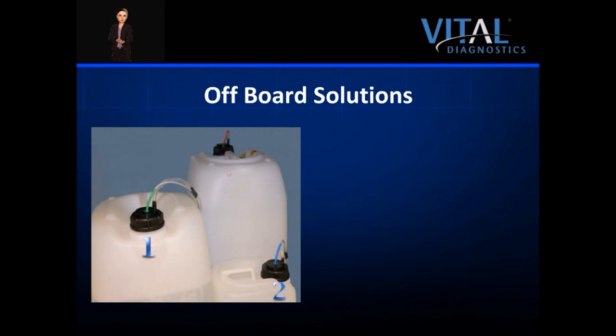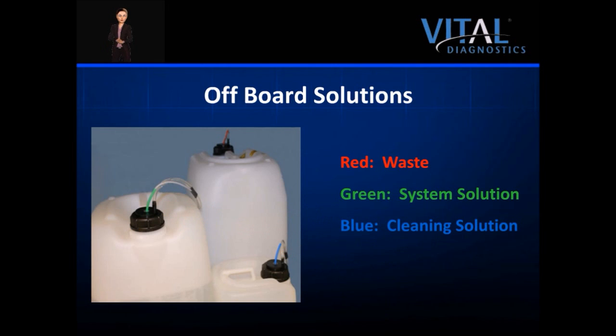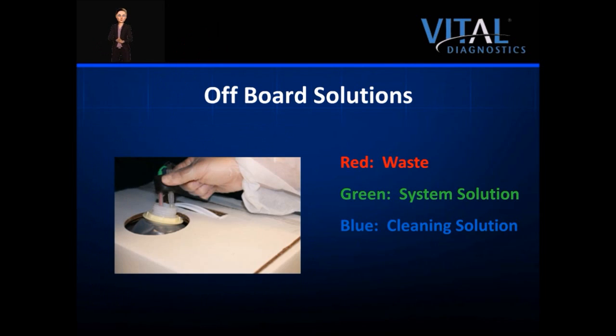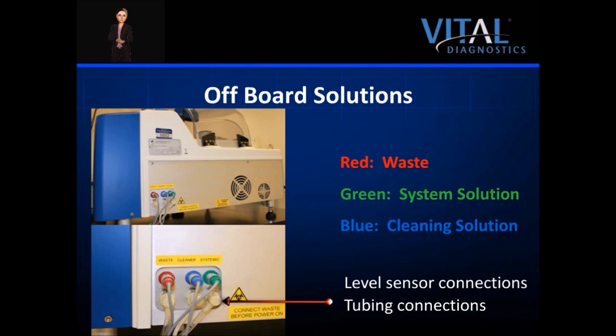There are two off-board solution containers and one waste container required for operation. The tanks can be stored under the analyzer. If the instrument is located in close proximity to the drain and local ordinances allow, the waste can be sent directly down the drain. The connectors for each solution are color-coordinated for easy identification: red is waste, green is systemic solution, and blue is cleaning solution. The connectors, tube, and level sensor attach to the screw cap. In some markets, such as the US, the systemic and cleaning solutions are provided in pre-mixed carboys, with lines connected through a stopper top. The connection ports on the back of the instrument are also color-coordinated, with the level sensor on top and tubing connected on the bottom by use of a one-clip system.